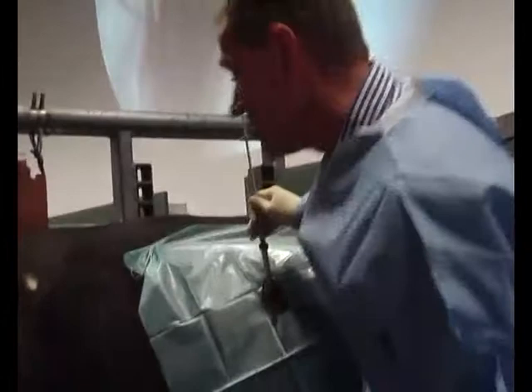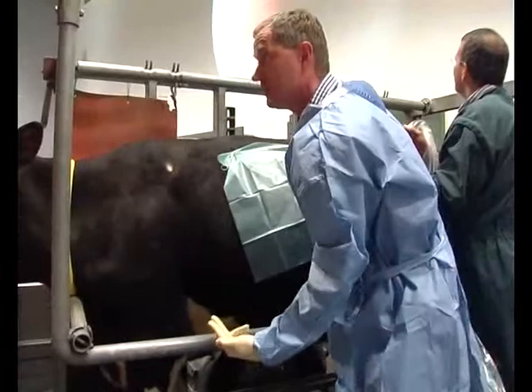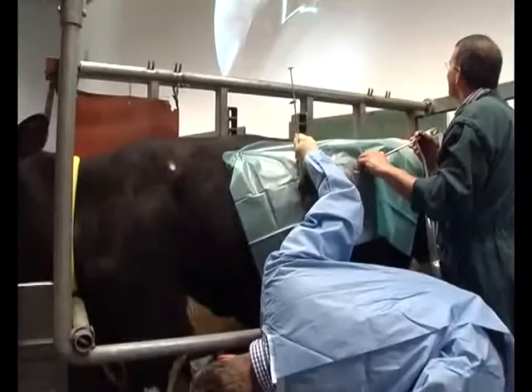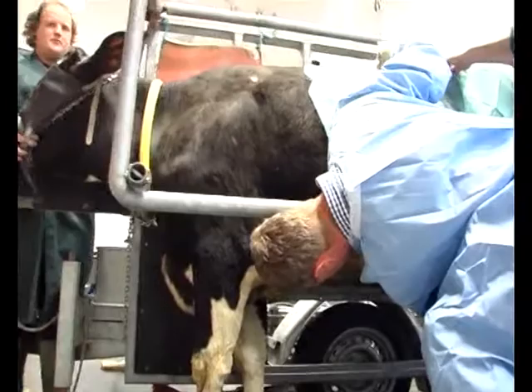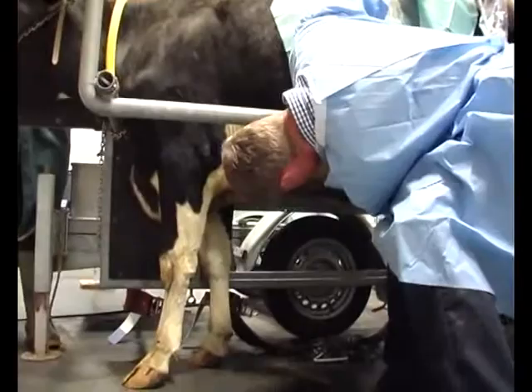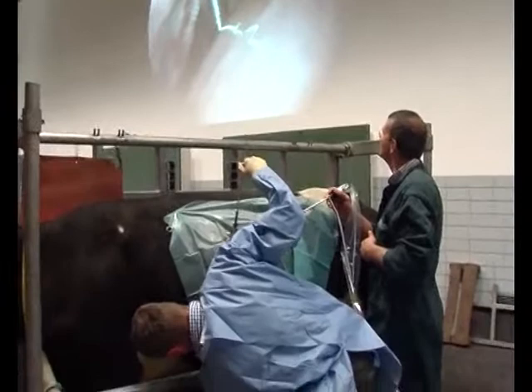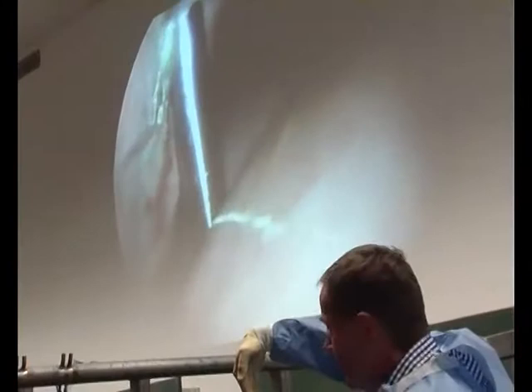This is quite a dirty cow on the other side. Well, I'm in an optimal position at the left side now. You can feel the tip there. I can try to push it to the other side with a small... Okay, I think I'm quite happy now. Just turn the applicator to be... Okay. Now I just don't hit, just start to push. And then she can kick.